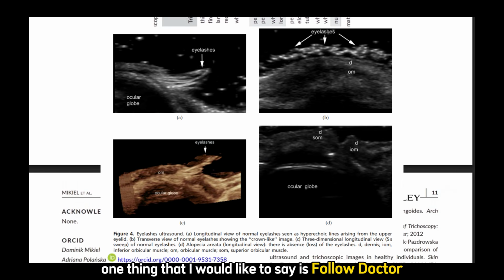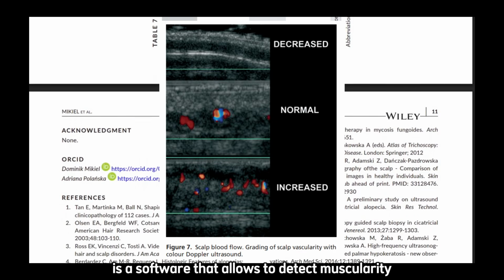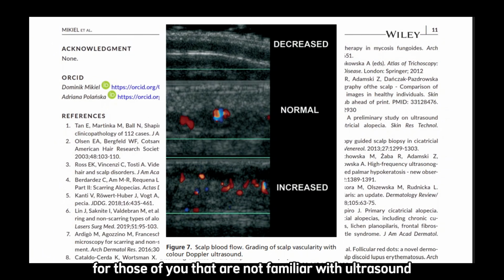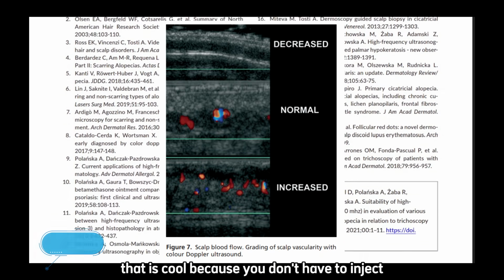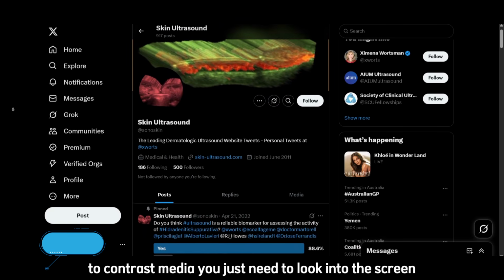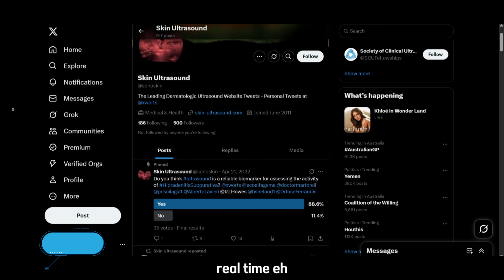One thing that I would like to say is that color Doppler is a software that allows us to detect vascularity. For those of you that are not familiar with ultrasound, it is important to explain that. That is cool because you don't have to inject contrast media. You just need to look at the screen and see the blood flow in real time.